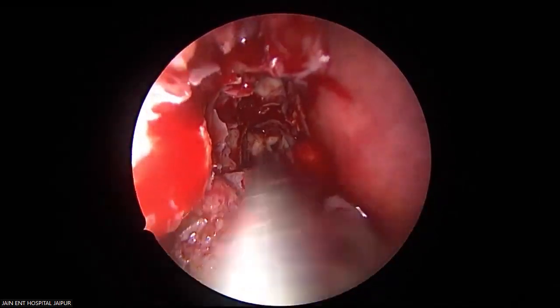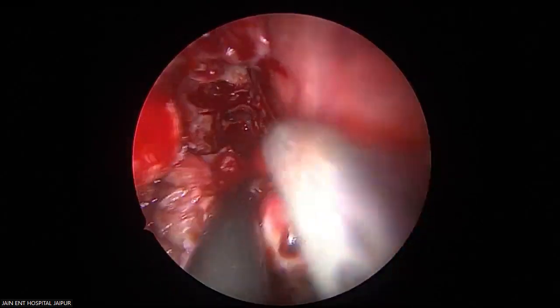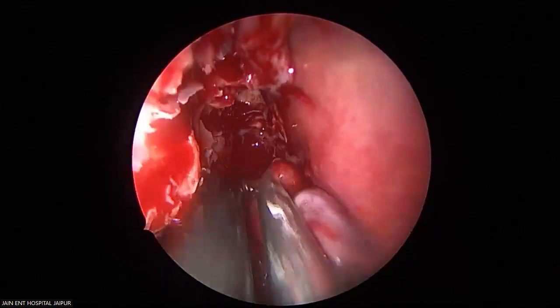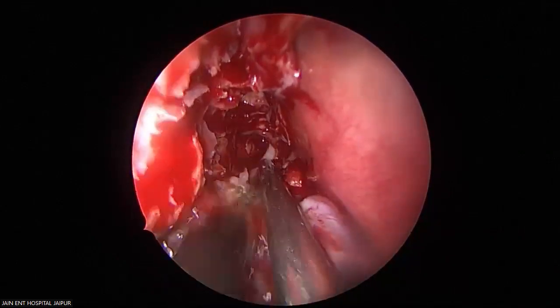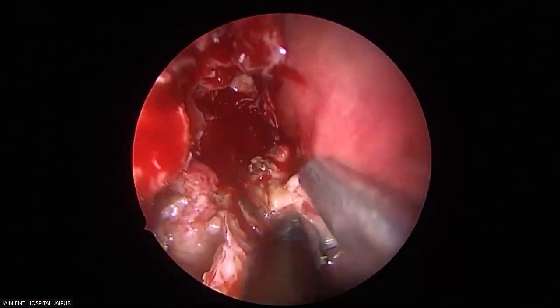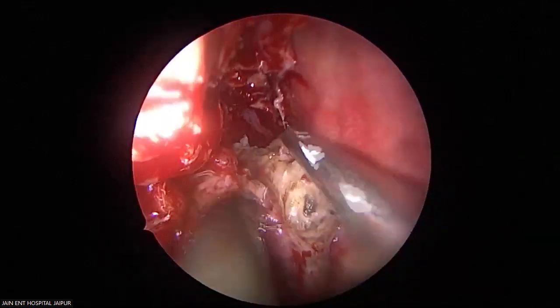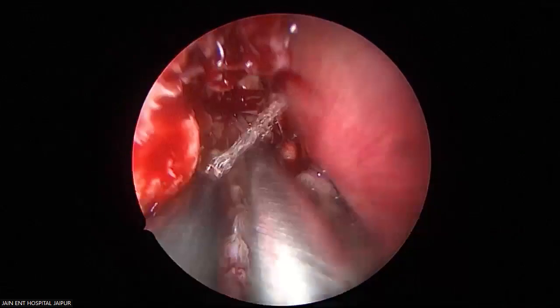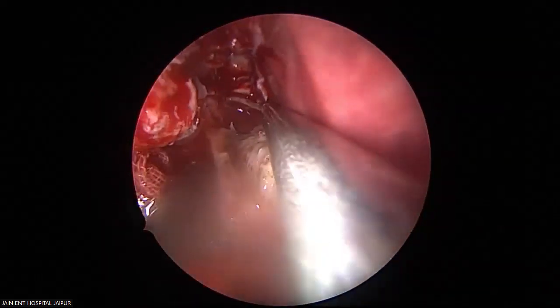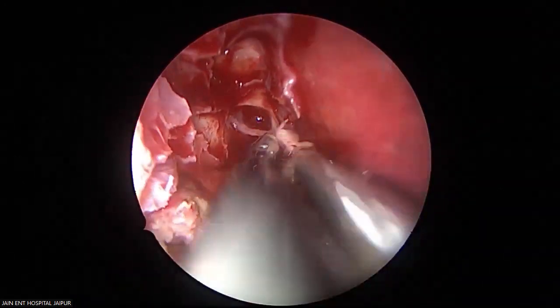See this? The tumor from superiorly. Please see this. This is the superior surface of the tumor you can see. Very clear. So more and more surface coming into picture, more and more surface coagulation is required.